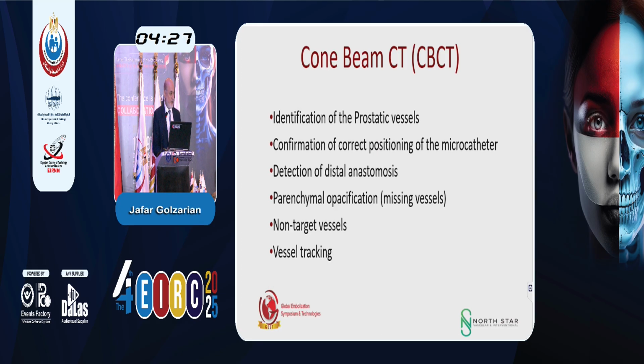So I'm going to pass to the cone beam CT, the importance of the cone beam CT.